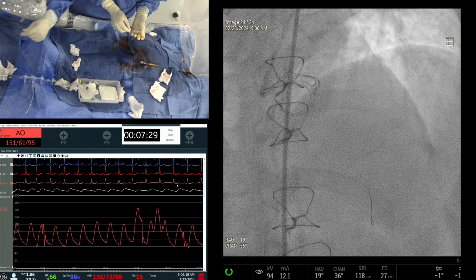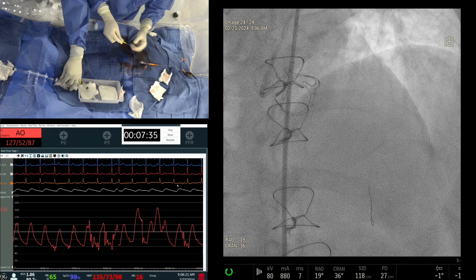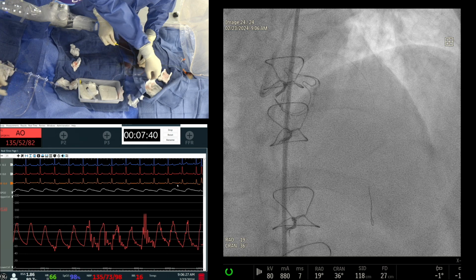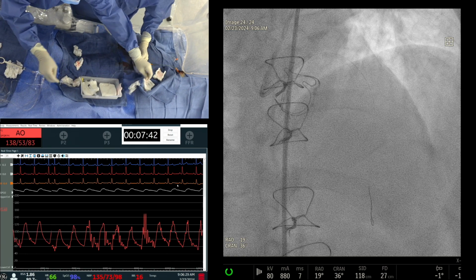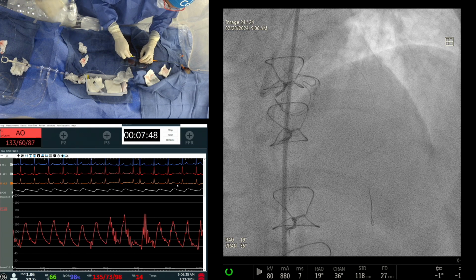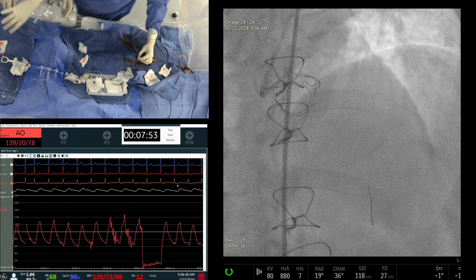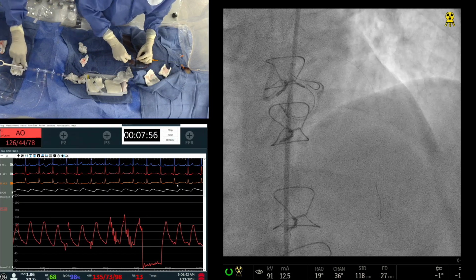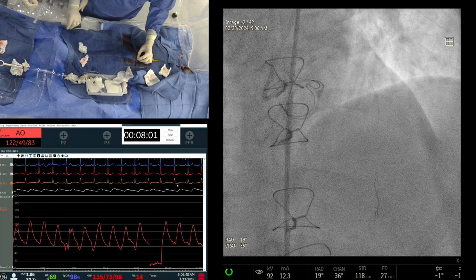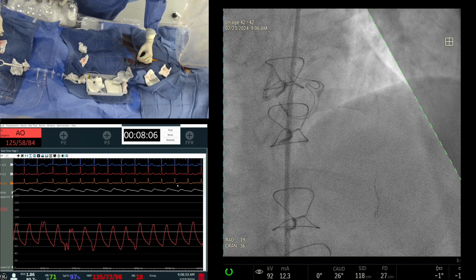But still, can IVUS detect that? Is there any indication that there is an eruptive nodule? The difference is the fibrous cap, the denuded surface, whether it is irregular or not. Of course, OCT is better for that. If you really want to differentiate, you need to get OCT to see the fibrous cap. You will not understand that with IVUS. Okay, so we are ready now. First, we are putting a wire into the circumflex, and then we're going to do IVUS into the LAD. You can do IVUS in both. Yeah.